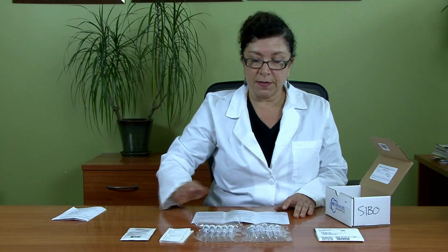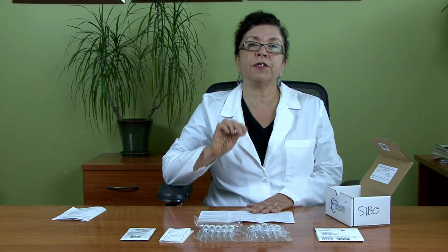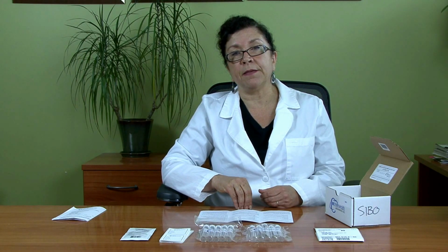Now, let's talk about the actual very specific diet that you have to consume the day prior to the test. Now, since we're testing for bacterial overgrowth inside the small intestine, we don't want you to eat any grains except for rice. Rice is allowed on this test. You cannot eat any vegetables, any fruits, any nuts or seeds, any dairy, or anything that is not suggested on the diet itself. The diet consists mostly of animal proteins and either white rice or brown rice. The rice has to be steamed.